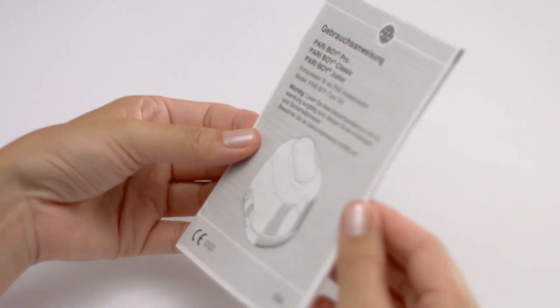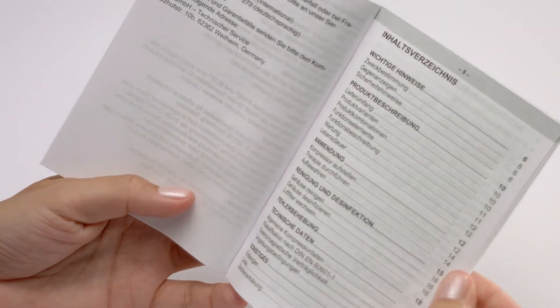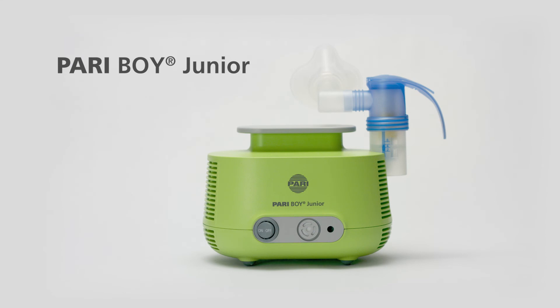Always refer to the instructions for use for details on how to use and clean your PARI nebulizer device, Pariboy Junior.